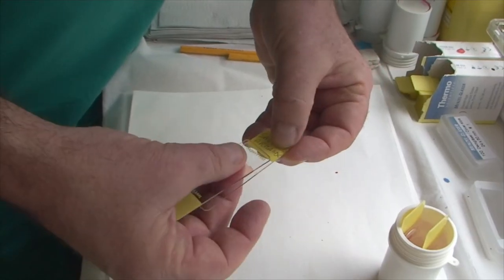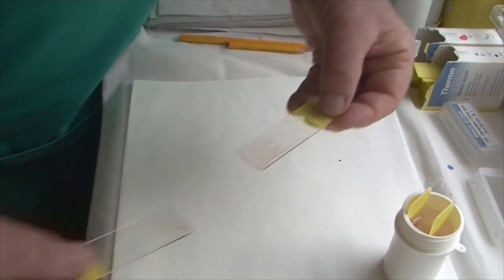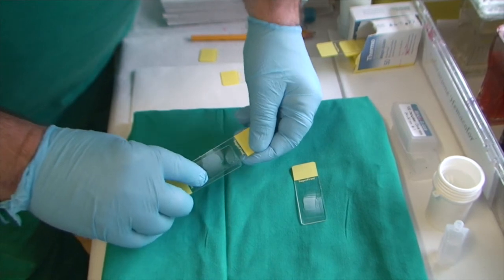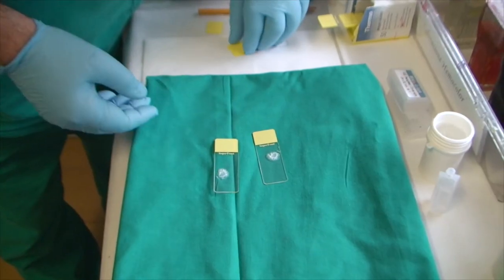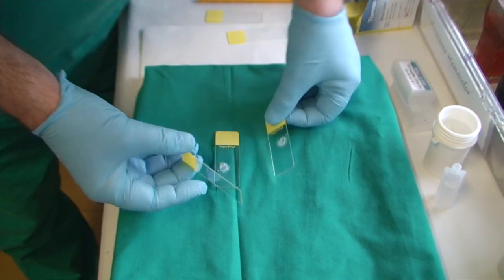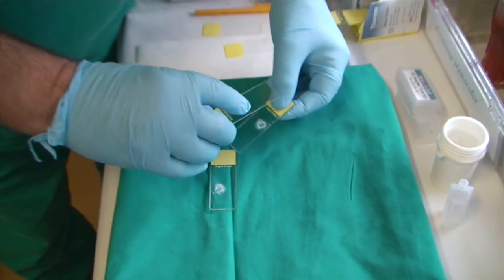There are two maneuvers for smearing. First, with two samples available and the specimen fairly liquid, smearing is carried out by applying one slide over the other. Second, if the specimen is solid, it is smeared by making use of another slide.